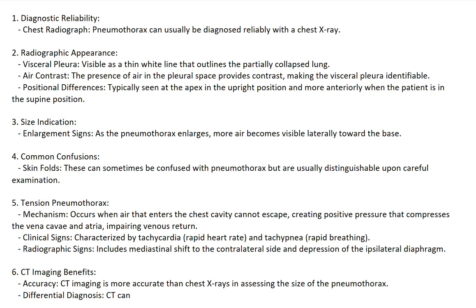Clinical signs: characterized by tachycardia, rapid heart rate, and tachypnea, rapid breathing. Radiographic signs: includes mediastinal shift to the contralateral side and depression of the ipsilateral diaphragm.